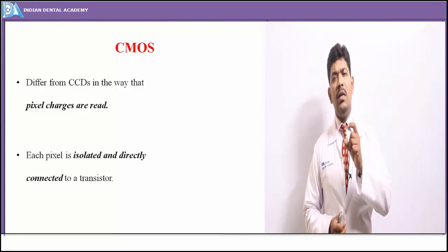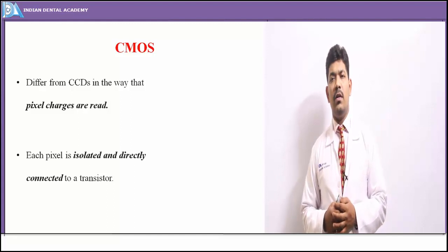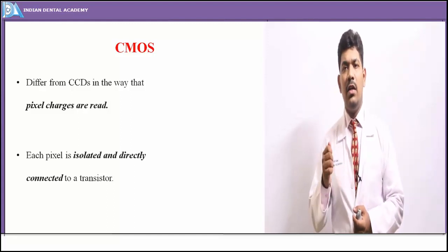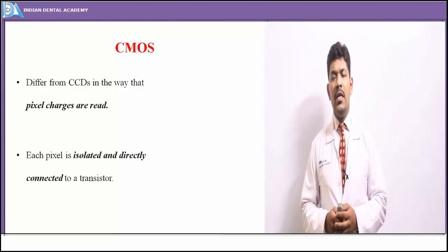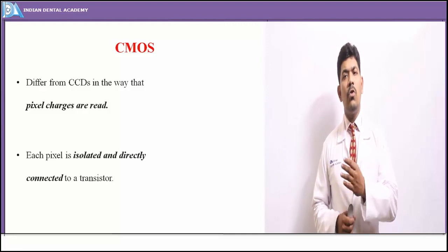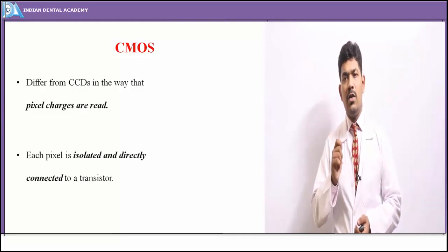Also the actual image receptor area within this bulk of the sensor is much smaller than the actual area of the instrument in hand. So there were more chances of image loss or cone cuts because of the lesser amount of area wherein it actually records the image.